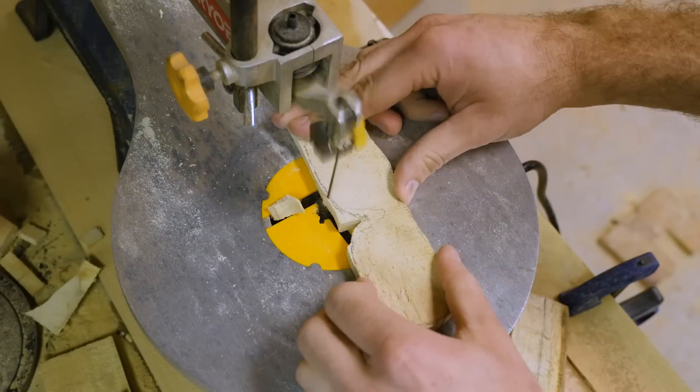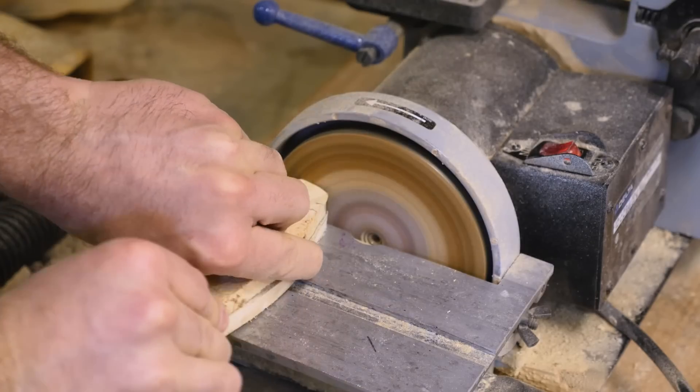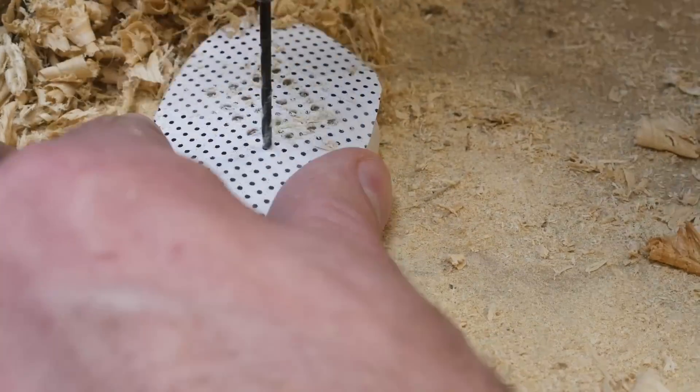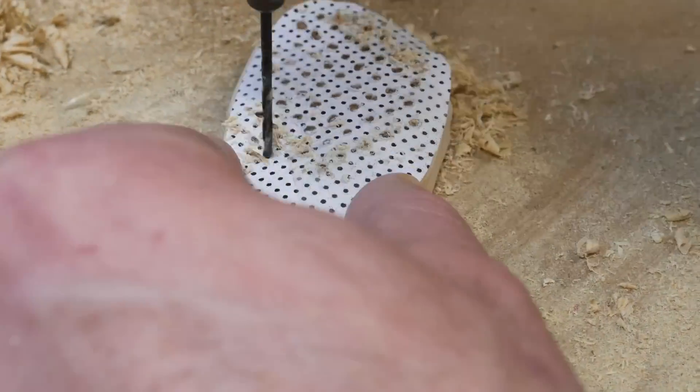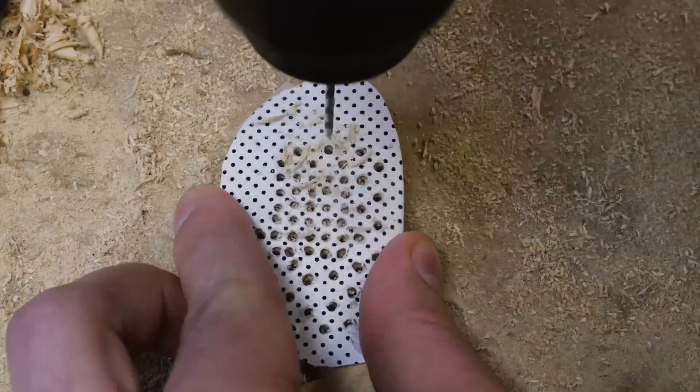Using some of the leftover wood from before — which you'll be seeing a lot more of in the future since I have a whole tree left over — I made a new set of glasses, this time with solid wood lenses. Then I drilled a bunch of holes into it. The science behind pinhole lenses is kind of interesting, in that it's a different technique to correct your vision.